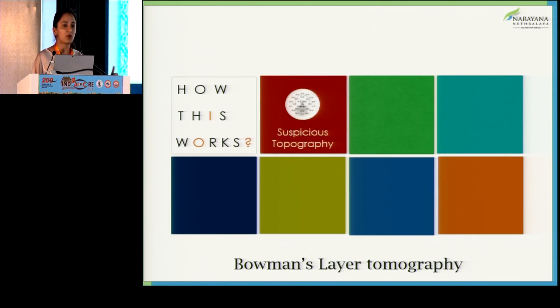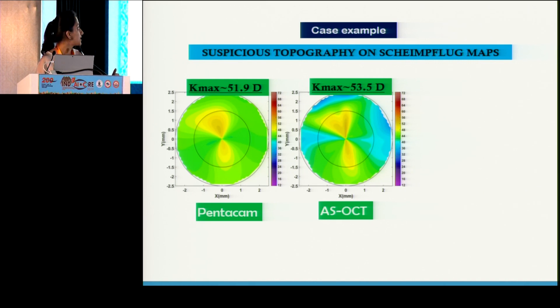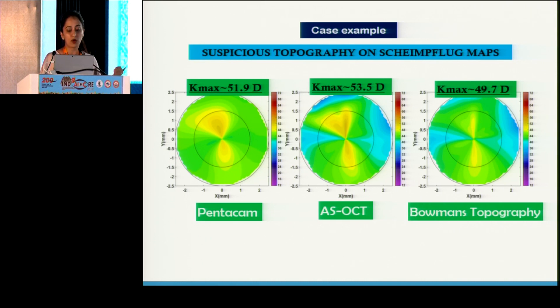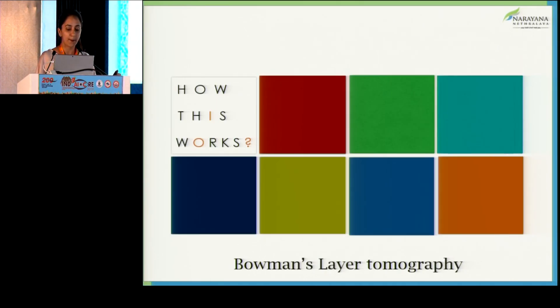So let's look at how this works and its applications. We all have these suspicious topographies — let's look at a case example. What is the Pentacam giving us? What is the AS-OCT? When we saw the Bowman's topography, it was actually a very regular surface, unlike what the Pentacam was providing us.